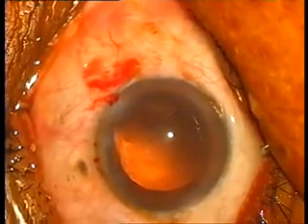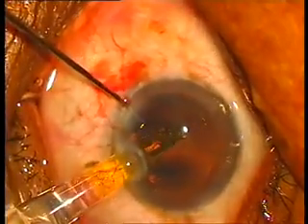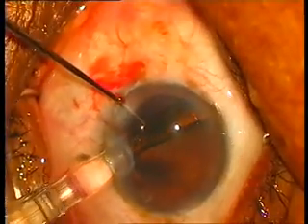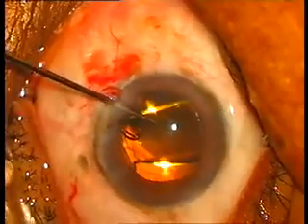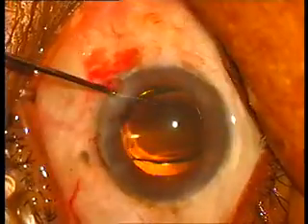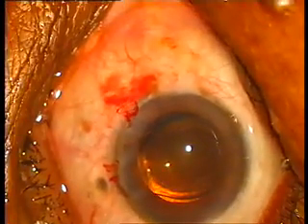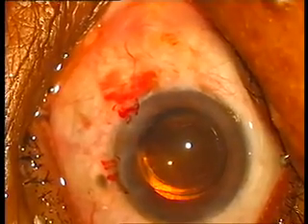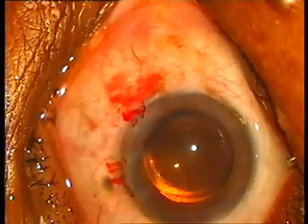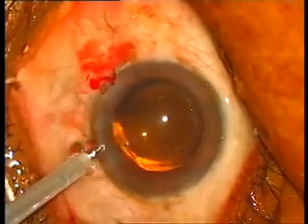I'll insert a little bit of methyl cellulose again to inflate the capsular bag, and then a foldable implant. It's a tinted yellow colored pigmented IOL. Yes. Now this completes our surgery. I just wash out the methyl cellulose using the irrigation aspiration cannula.